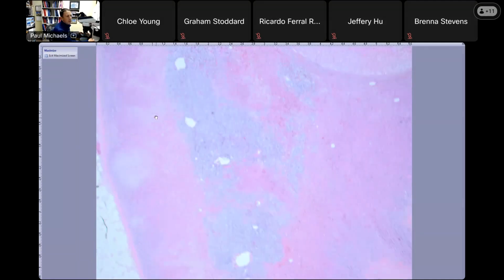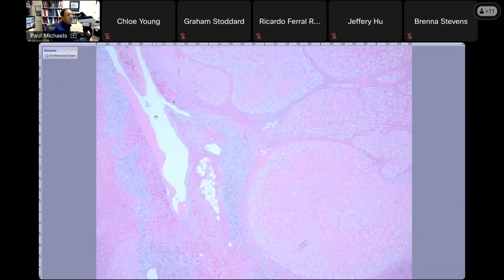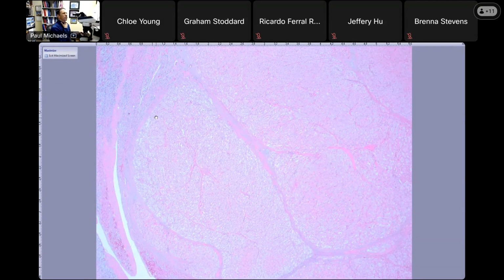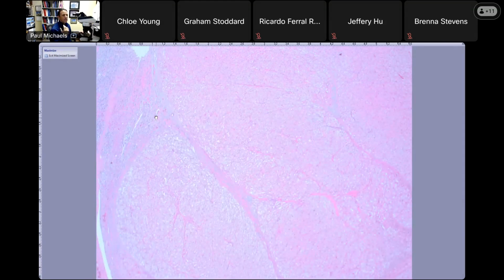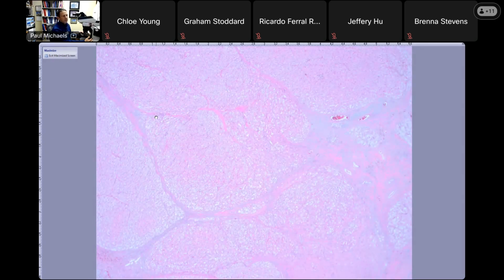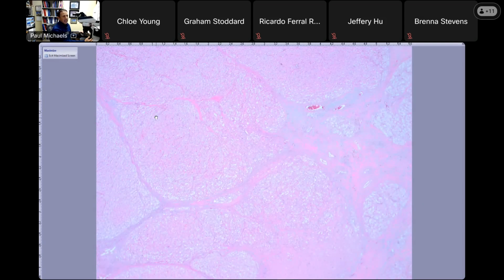And then here's the one I was talking about where I had a core biopsy. This is when I was in Austin. I remember them presenting this at tumor board before they had done tissue. They had just done a CT scan, I don't think it was a screening, it was for abdominal pain, GI kind of symptoms, diarrhea, et cetera. And they found this 4 or 5 centimeter adrenal gland mass, and the radiologist said, oh, it's kind of suspicious looking, whatever. It's not that big. It's in the adrenal gland.